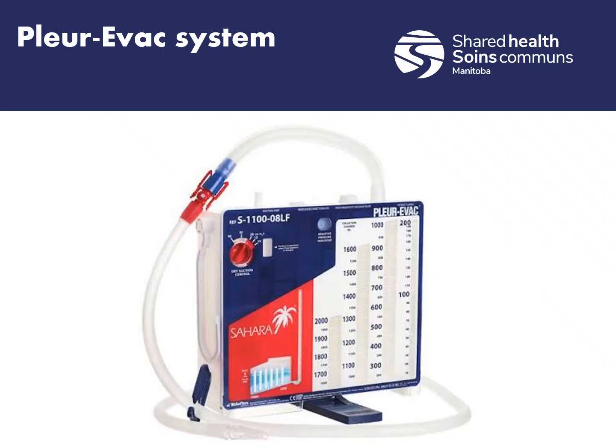So let's review the different parts of the PleuraVac system. Since we're going to be using this, it's good to familiarize ourselves with all the components. The first component we're going to look at here is the patient drainage tube connector and tubing. The red clip is attached to the chest tube catheter to establish a one-way seal for pleural drainage. The locking red and blue connectors provide a quick connection if there needs to be a change in the drainage systems, which we're going to talk about a little bit later.